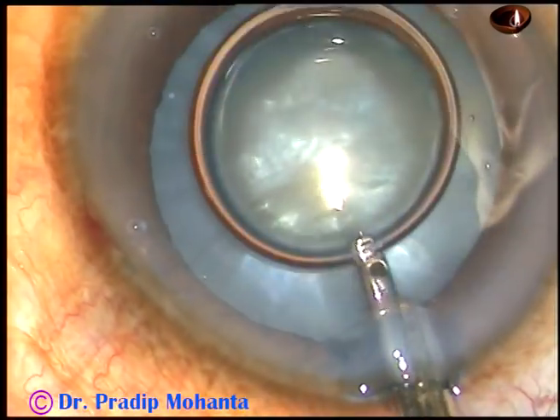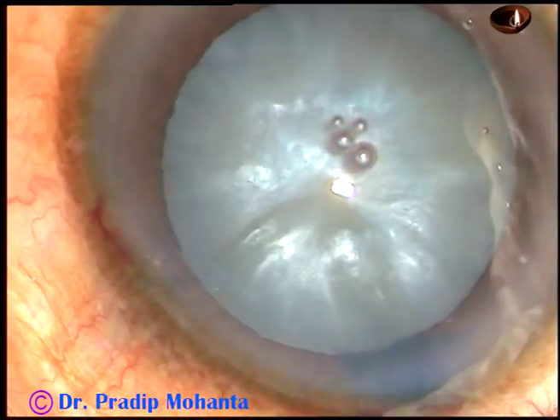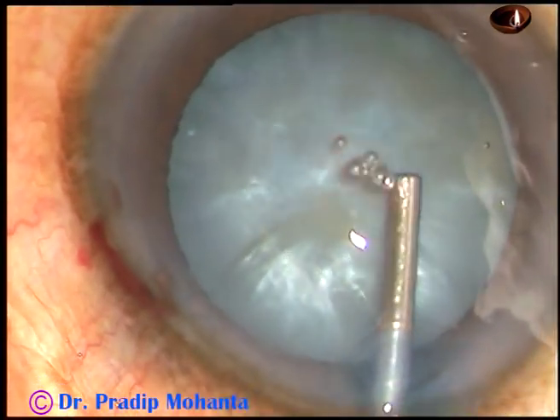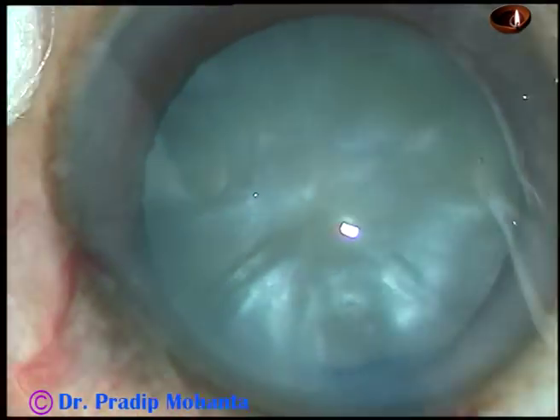Wash the dye out with BSS balanced salt solution and then inject viscoelastic substance. I inject 2% HPMC in all intumescent cataracts. If you are comfortable, you can inject sodium hyaluronate.